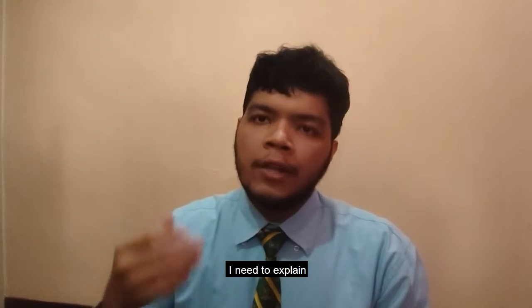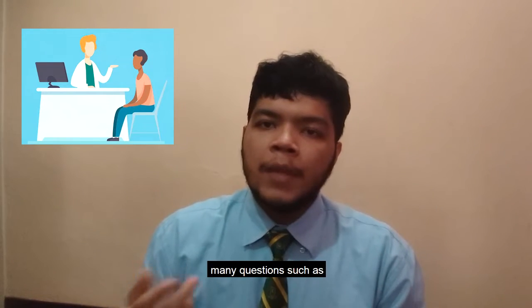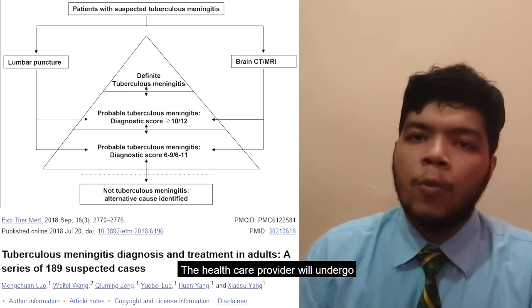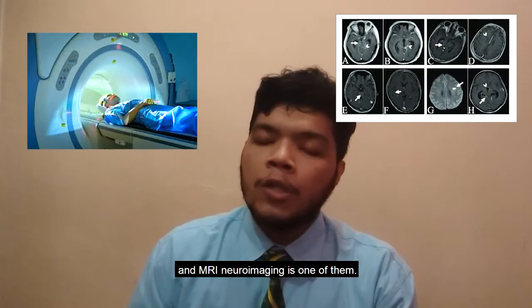But before that, I need to explain how MRI imaging is conducted. The healthcare provider will ask many questions such as patient history with tuberculosis and symptoms that have or had happened in the patient. The healthcare provider will undergo multiple examinations to get more evidence, and MRI imaging is one of them.